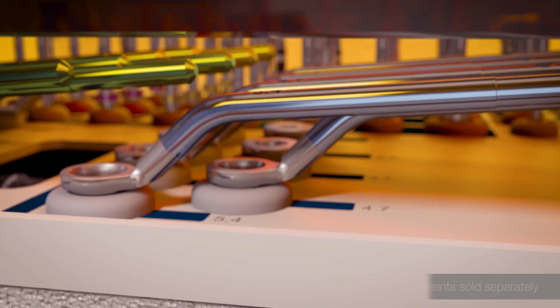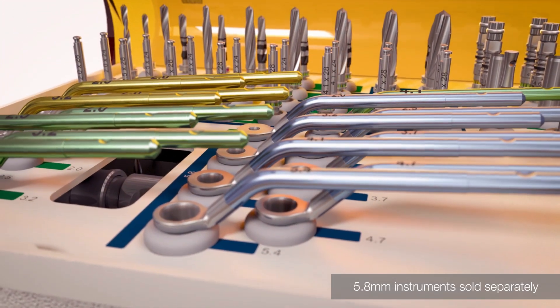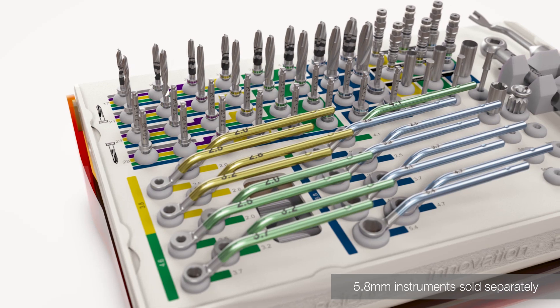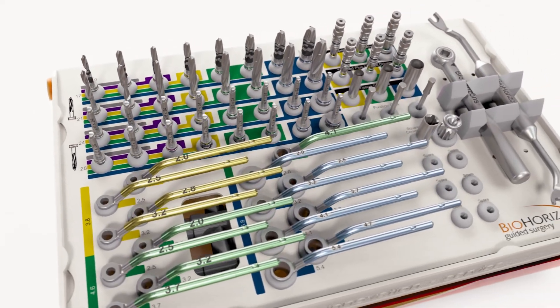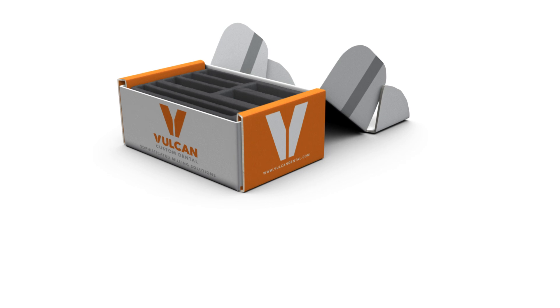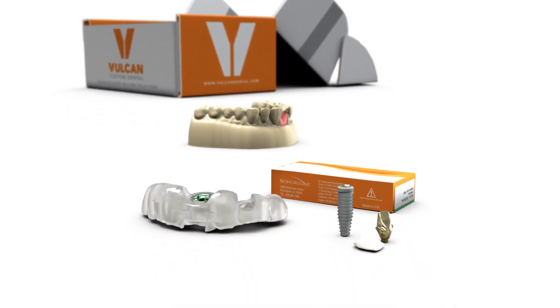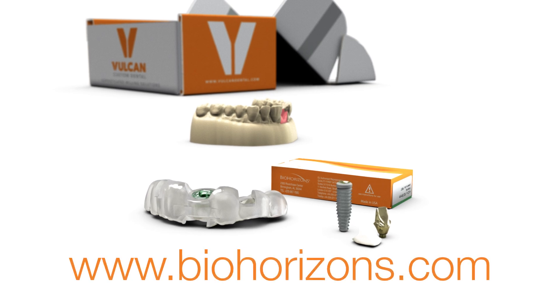The BioHorizons guided surgery kit offers the precision and predictability of guided implant placement with a streamlined single kit design. Surgical guides are available from Vulcan Custom Dental and many other guide partners. For a full list, visit the BioHorizons website.